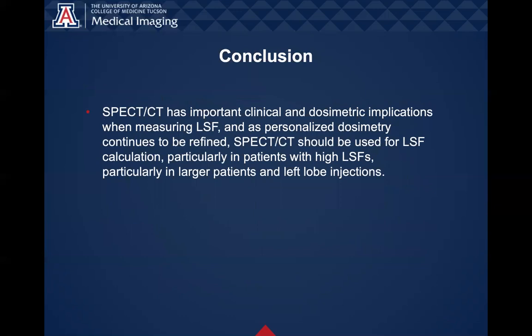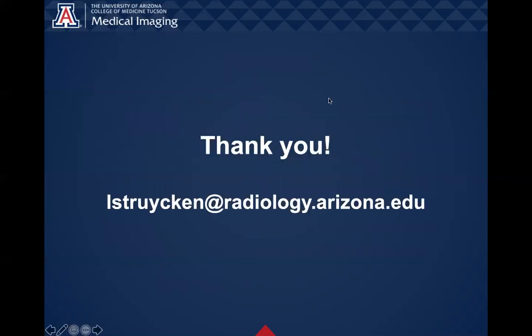So in conclusion, SPECT has important clinical and dosimetric implications when measuring lung shunt fraction. And as personalized dosimetry continues to be refined, SPECT should be used for LSF calculation, particularly in patients with high planar lung shunt fractions, and particularly in larger patients and left lobe injections. Thank you so much.